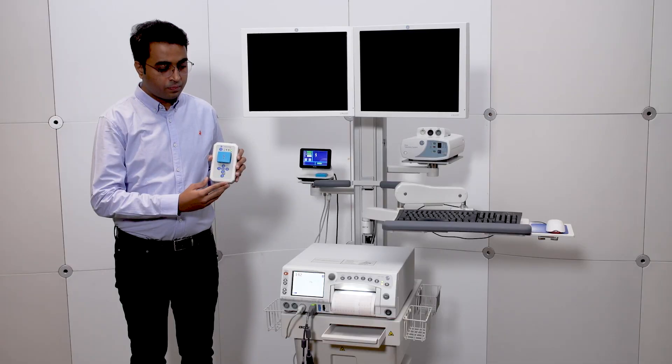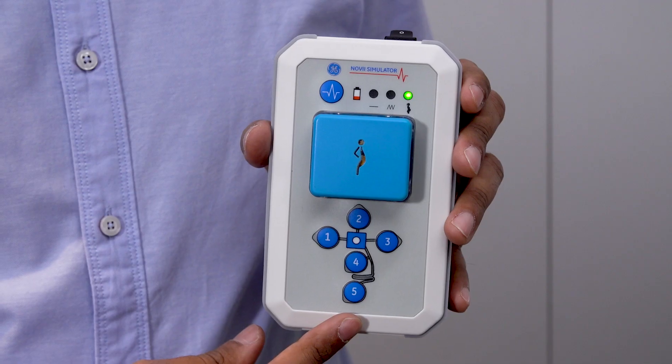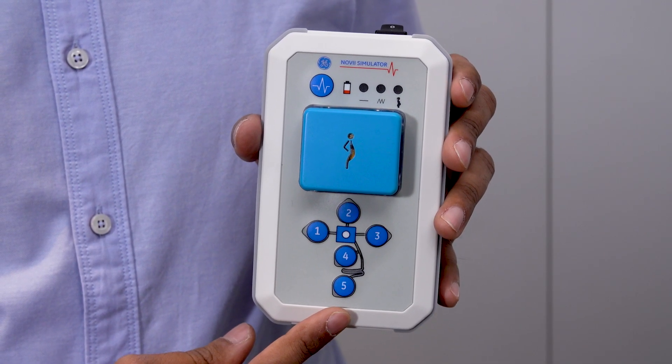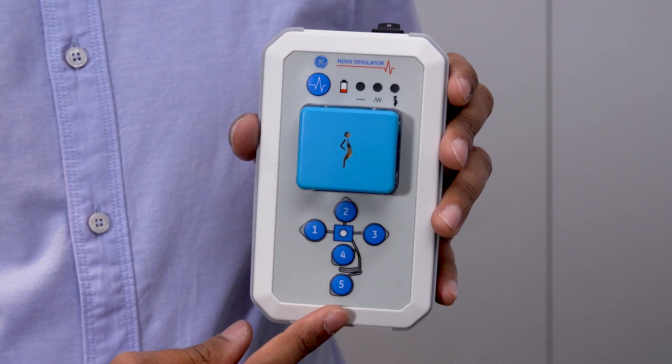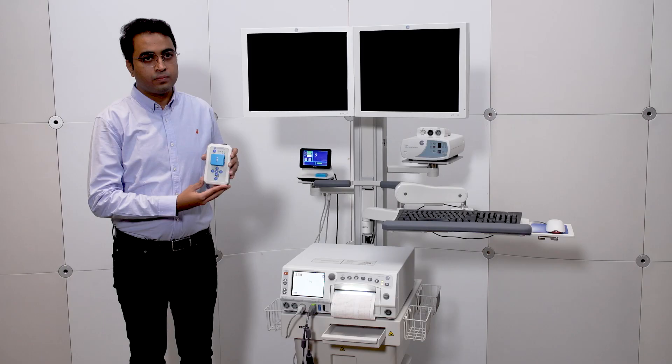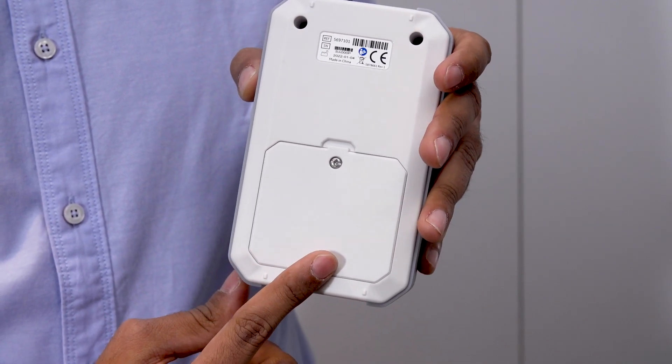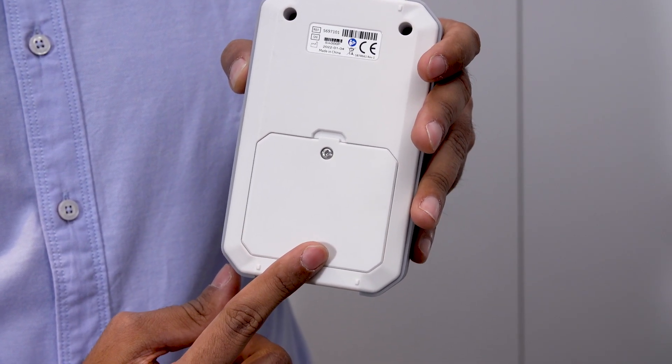Right below the simulator pod clip are the electrode disconnection buttons. Electrode disconnection buttons in Demo mode lets you simulate the electrode disconnection of the Novi wireless patch system. On the backside is the battery compartment, which has two AA alkaline batteries for powering the Novi simulator.